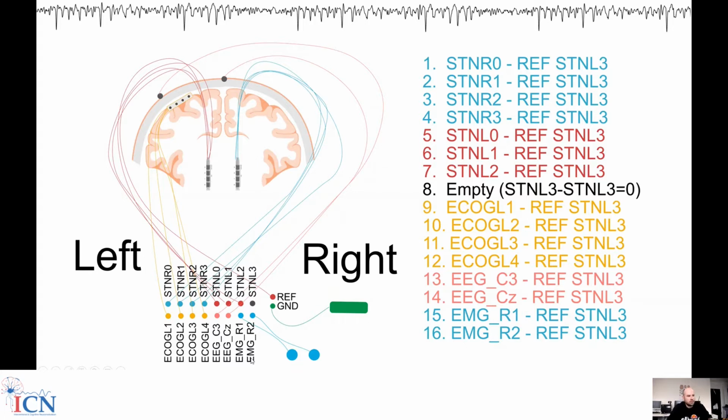And depending on your specific setup, you may have an EMG electrode that you could either connect here, or you may have additional strict bipolar channels as they are implemented in the TMSI Saga. Then you don't need to connect and reference them to the LFP.